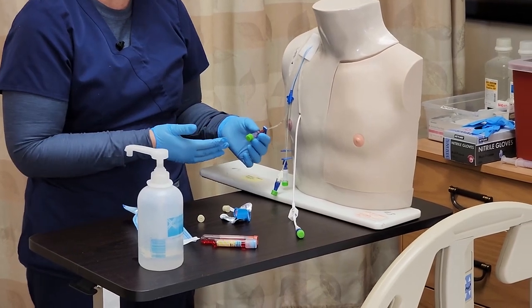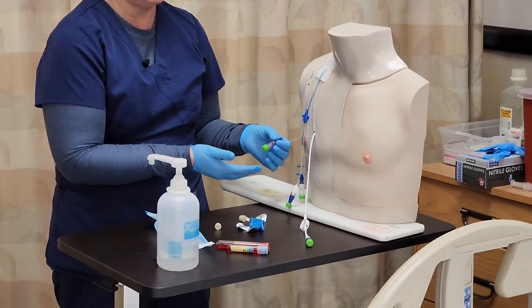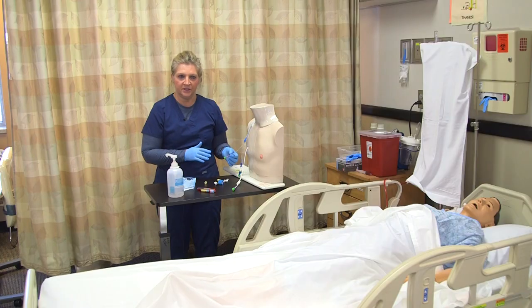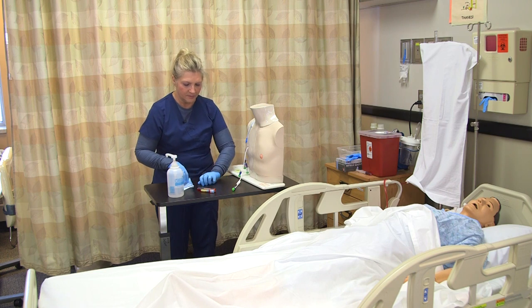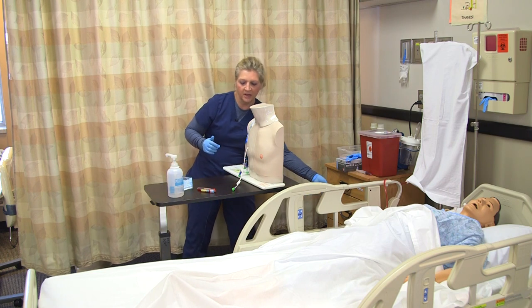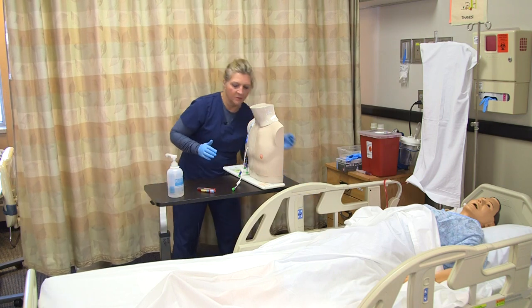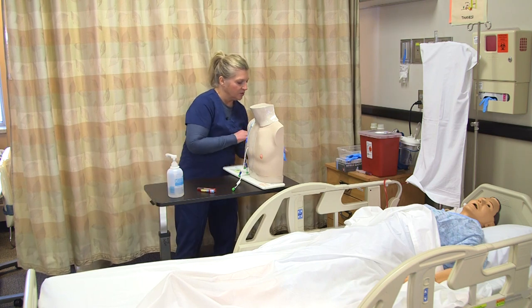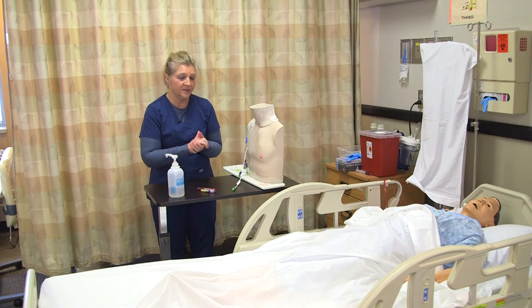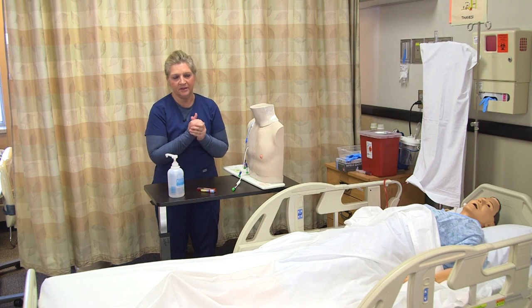If your needleless connector has gotten soiled or contaminated with blood, you can go ahead and change it per your policy. Now, with my blood collected and my patient present, I'll label my blood tubes in front of my patient, transfer them to the lab as soon as possible, and then document the procedure and monitor my lab values as ordered.